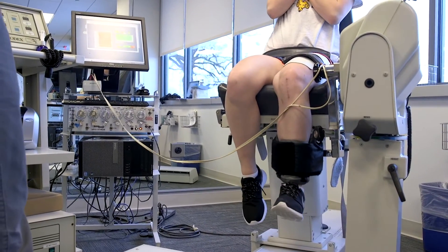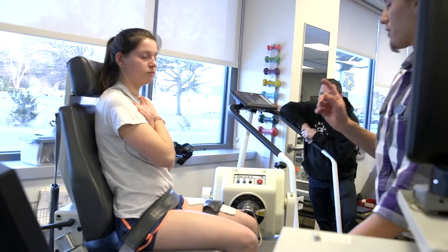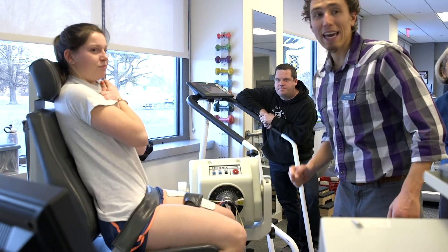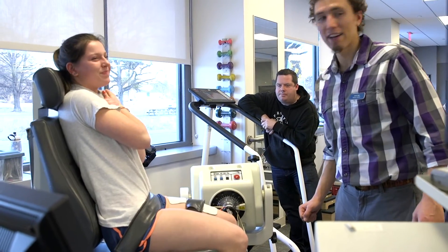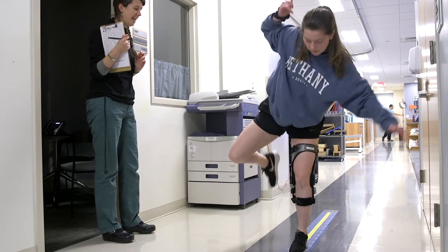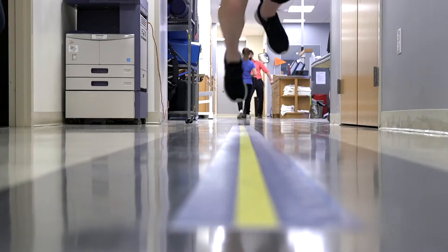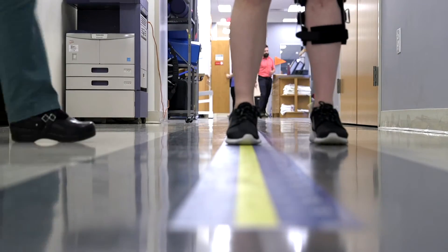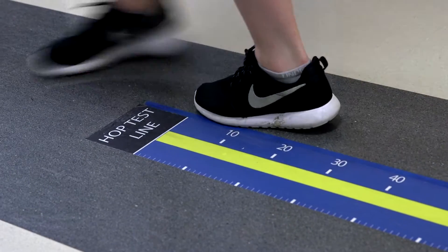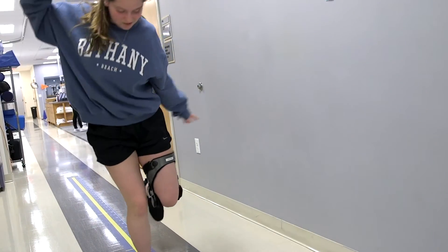We look at functional tests, so we look at strength — particularly how strong their quadricep muscles are, which is a muscle that has significant problems with activation and atrophy after ACL injury and reconstruction. We also study how they jump, which is a great way to look at interlimb symmetry in a functional manner similar to going back to sport. We have them perform a series of hop tests and compare those side to side to see if there are deficits that persist on the involved limb.